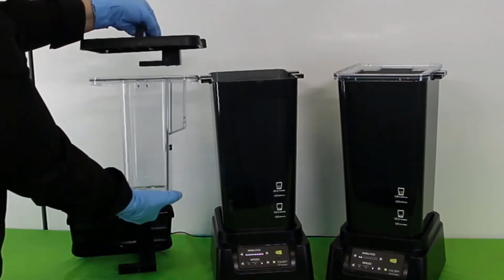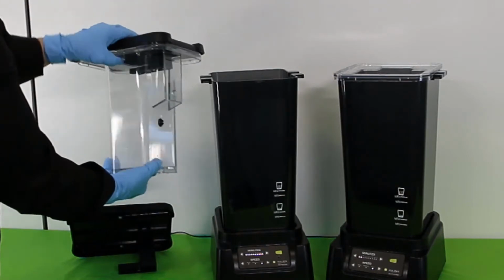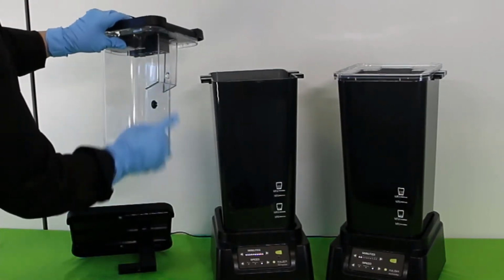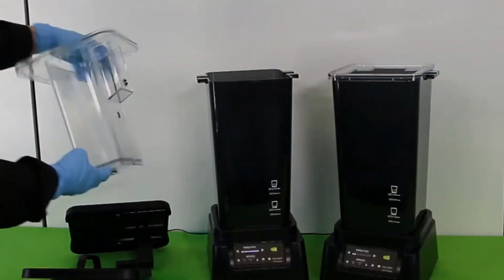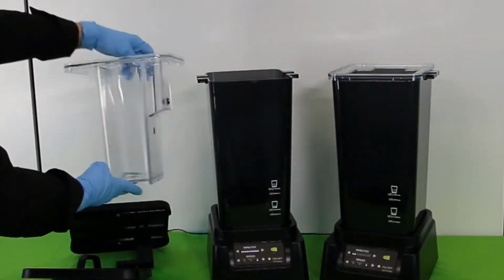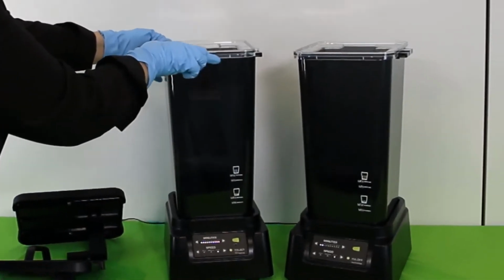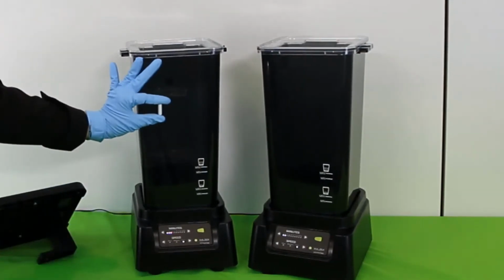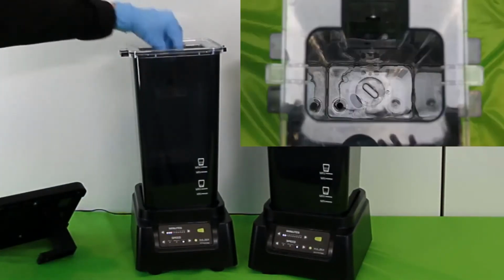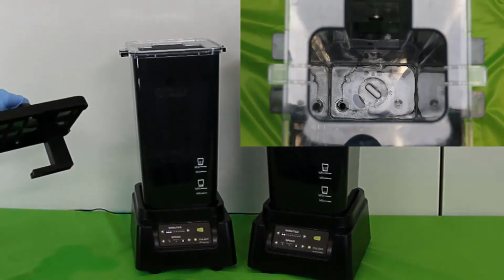For working with the small build table hanger, the lower overflow hole must be closed. Therefore, the isopropanol can circulate by the higher hole. Before inserting the inner container, fill the outer container of the Cara Print Clean with the required amount of isopropanol. Place the magnetic stir bar in the empty inner container. The magnet in the bottom of the device automatically pulls it into the correct position.